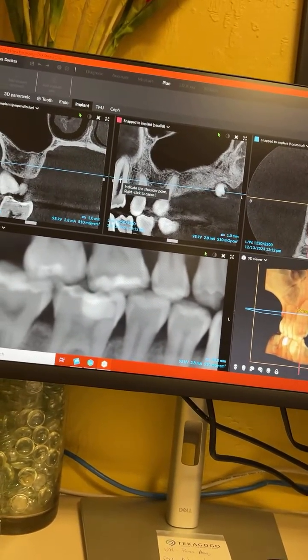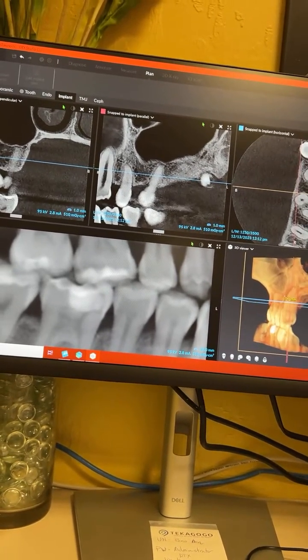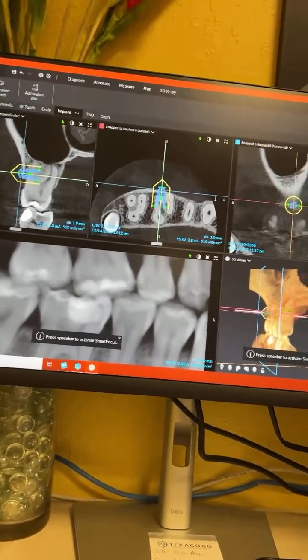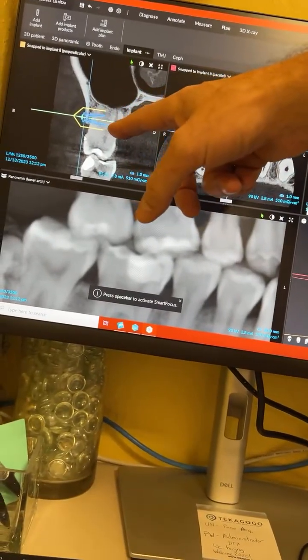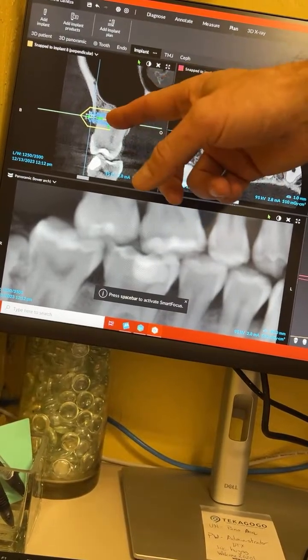So number 3, where do I do it? Oh, different tooth. No, just focus on this one. That's not a good place to put it there because you can't see. Well, you did it. You can click on it here. Okay, I see the plus and the arrows that come up? Mhm. Keep going. There you go.